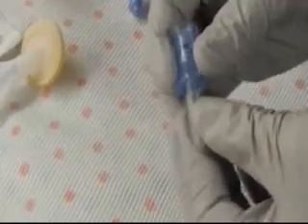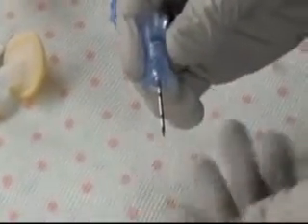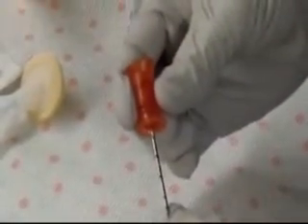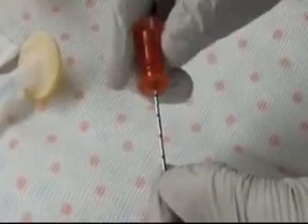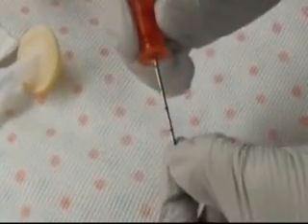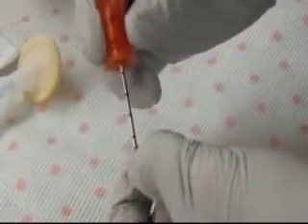The blue needle is the adult needle for your average size adult, and it's used for patients that weigh over 40 kilograms. And then this very large intraosseous needle is used for patients that have large adipose tissue or may be very muscular in build, and the standard adult needle will not work. This is also a 15 gauge needle, but is 45 millimeters in length.